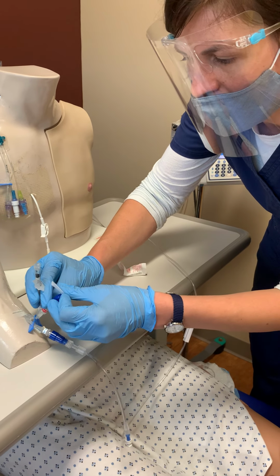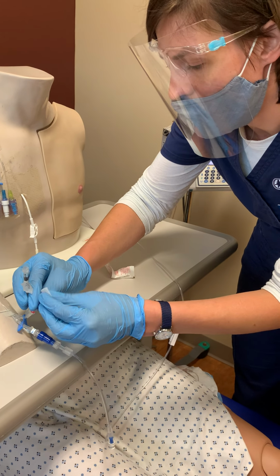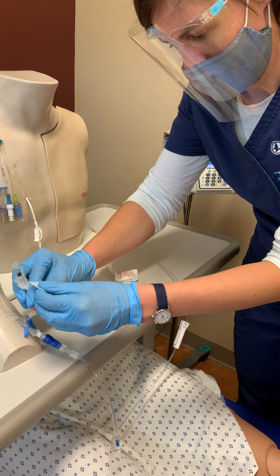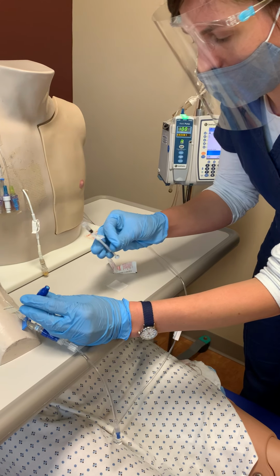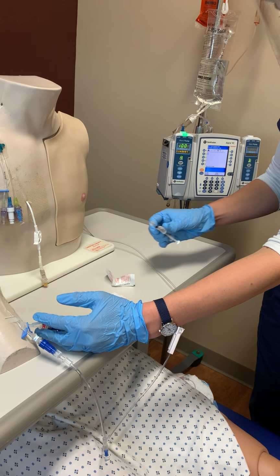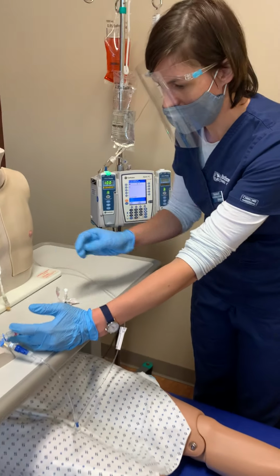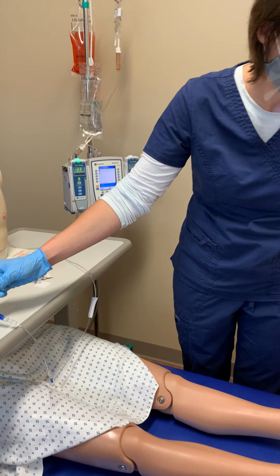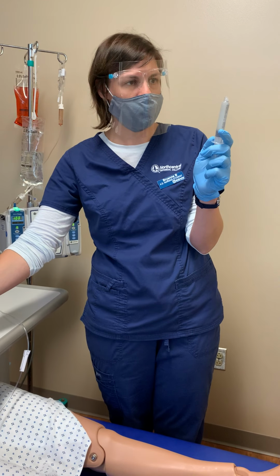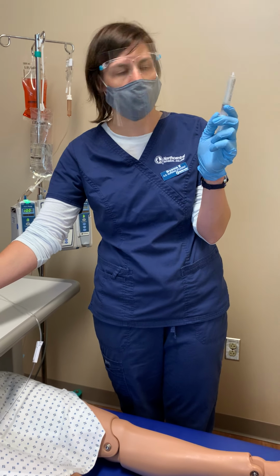I believe I mentioned previously the morphine is compatible with the normal saline and the potassium, but we're going to use this other lumen since it's available. 15 seconds per company protocol, and I am letting it dry. Before I do that though, I am going to flush, propping that so it's not touching. Making sure beforehand I did make sure all the air bubbles were out of all 3, but I'm looking just to be certain this time, and we are good.